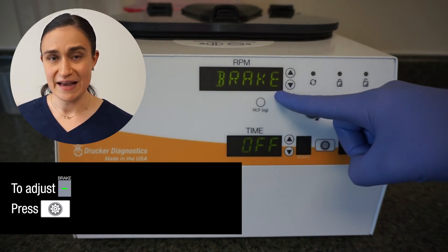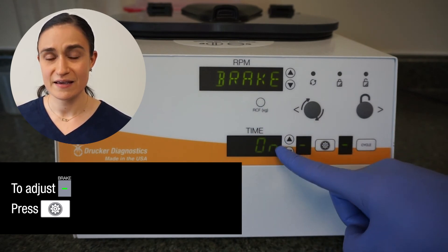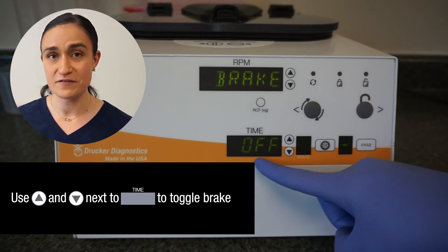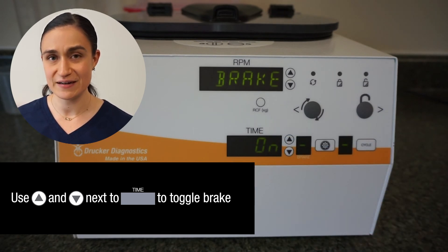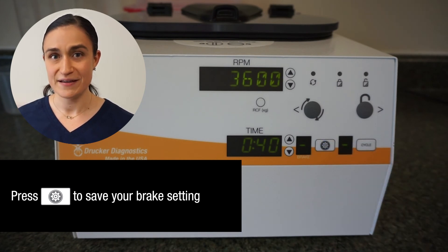The word 'brake' now displays in the RPM screen, and the words 'off' and 'on' can be toggled in the time screen. By default, the SARA-12 brake is off. If you want to engage it, simply press the up button next to the time screen and you'll see the word 'on' appear in that screen. Once you're finished adjusting that, press the button to exit. The brake is now engaged.